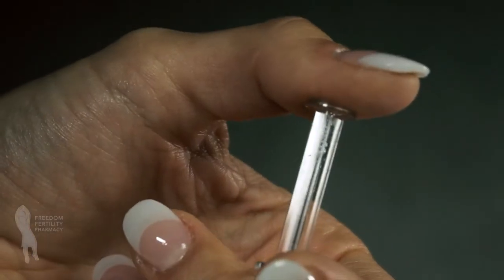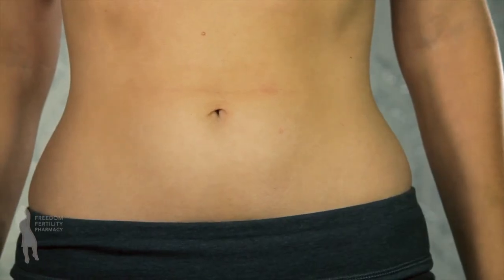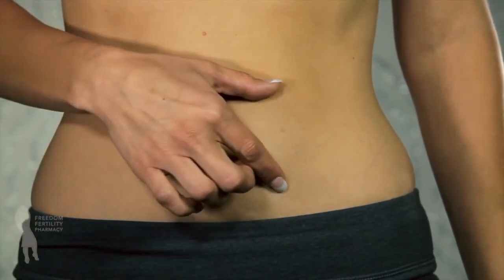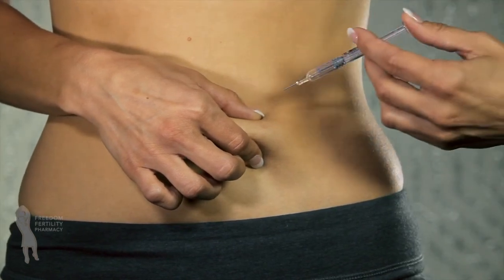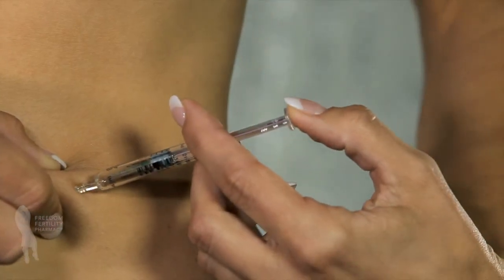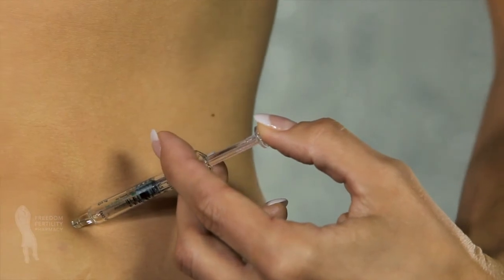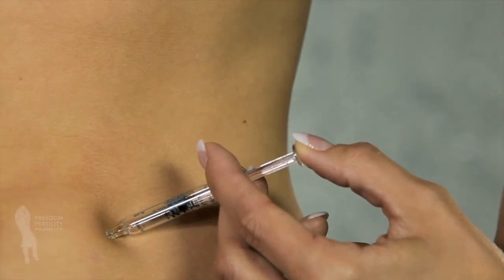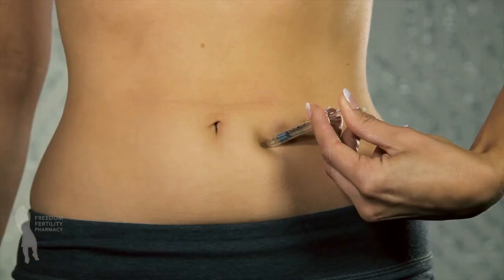Hold the syringe in your dominant hand like a pen or pencil. With the other hand, gently grasp a small fold of skin between your thumb and index finger at the selected injection site. Insert the entire length of the needle into the fold of skin at a 45 to 90 degree angle. Once the needle is inserted, release the pinched skin and push the plunger in a slow, steady motion until all the medication is injected.